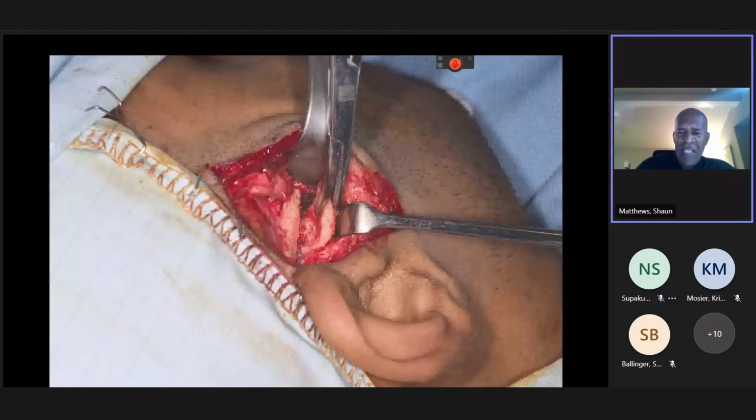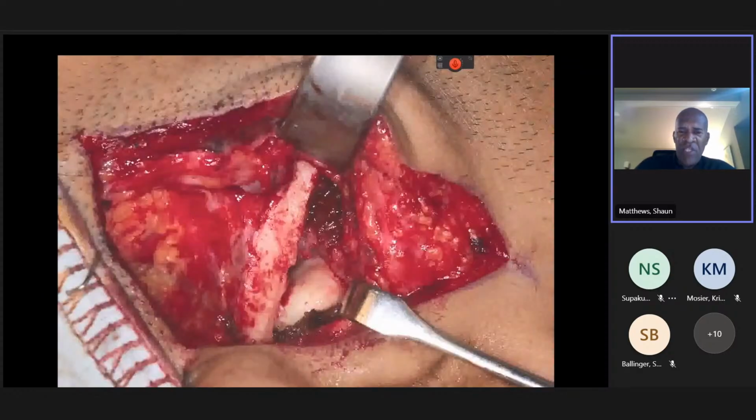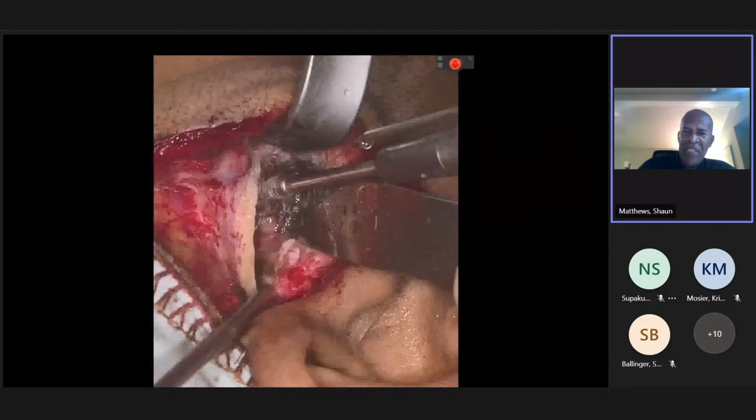And that's the end result. And that is a nicely demonstrated TMJ eminectomy procedure because we have removed the articular eminence. We smooth the bone off and we have a nice clear ledge and job is done.